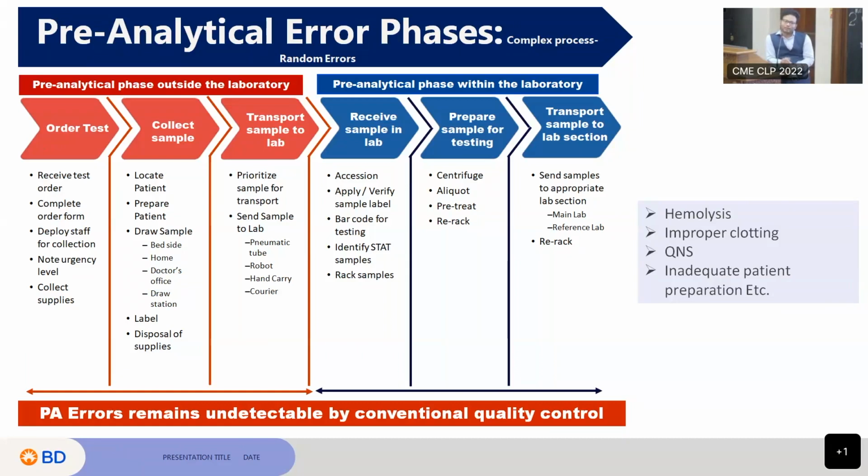But the thing is, if you have a larger volume of samples to collect, like 7-8 tubes, it is very evident that there will be lesser blood flow, because blood vessels will try to collapse. Most of you must have faced that your fluoride tube doesn't have the pressure, right? The blood sample comes very slow. The fluoride tubes are designed such a way, they have very low pressure, it is a small volume of sample, and you just have to keep the tube inside the vein a little bit more time, so the entire blood should come.